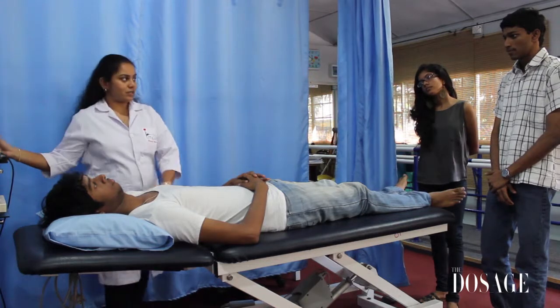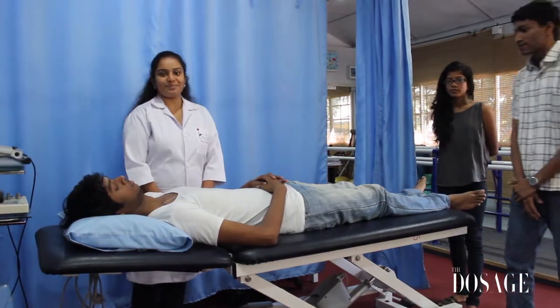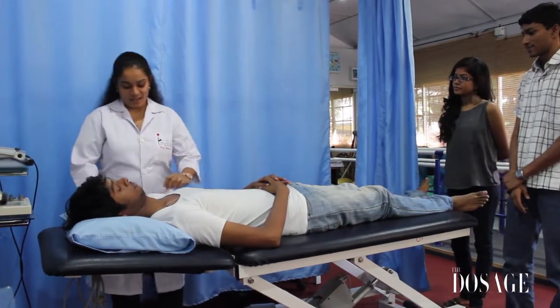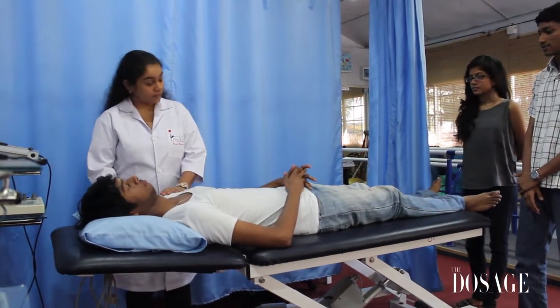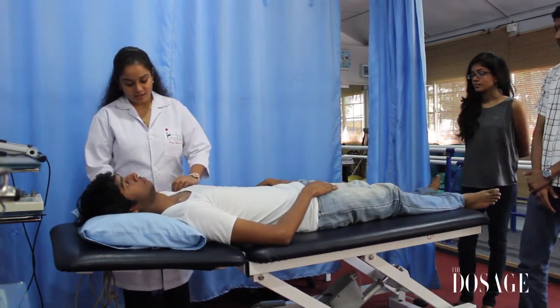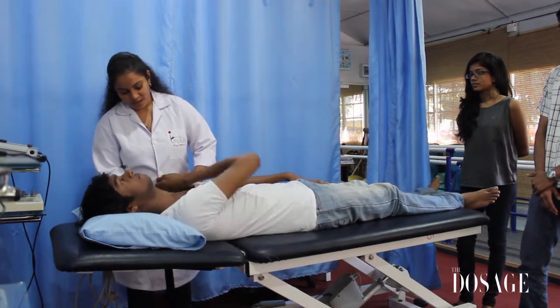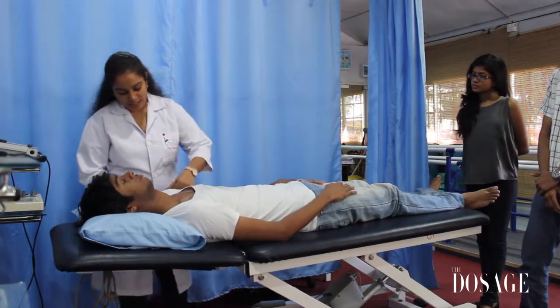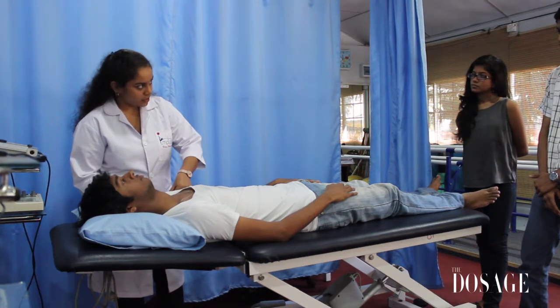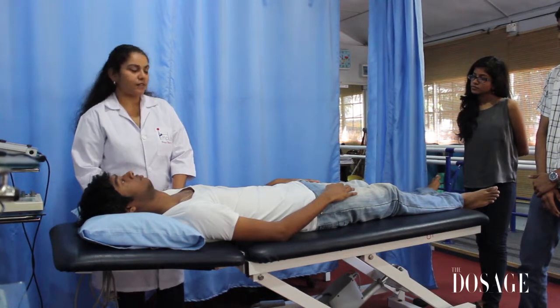So this is the ultrasound machine. So shall we begin? Yeah. So just walk us through the process, doctor. Okay. So first of all, I have to assess him. I have to take the basic assessment. So he got an injury over here. It's just a mild injury. I'm going to treat him with ultrasound. I have done all my basic assessments for him, and I'll start with my treatment.